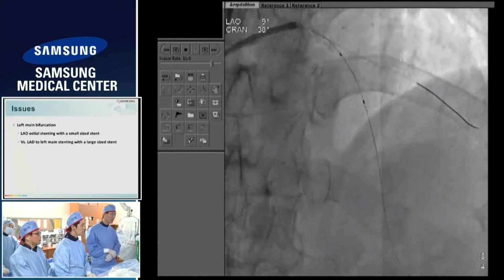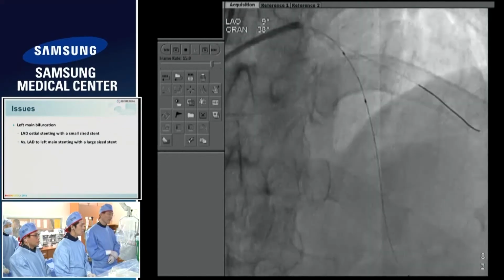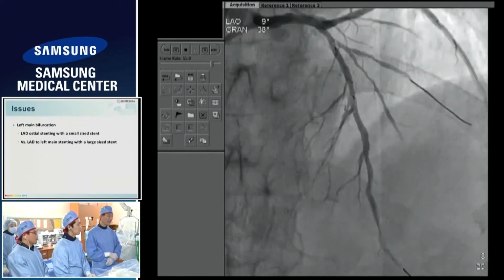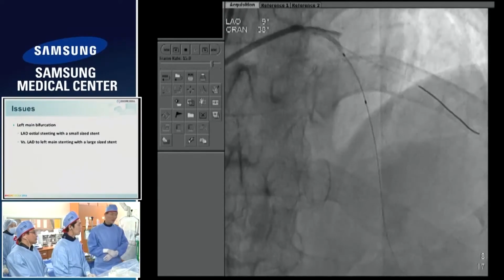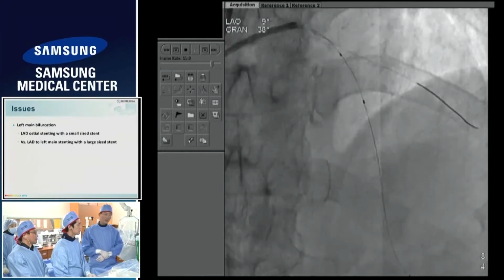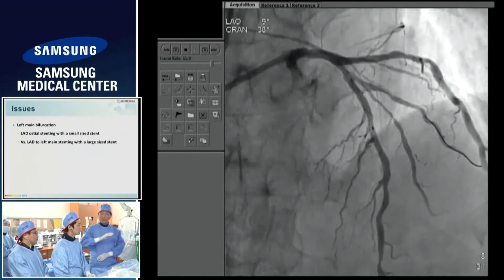So anybody wants the side branch ballooning here? Yeah, I like to stay away from that actually. The long lesion, at least less than 2.5, maybe. In the IVUS, the diagonal ostium is 2.75, so the lower limb is smaller than that, at most 2.5, so long lesion, I like to stay away from that. That's why I wired the upper limb.